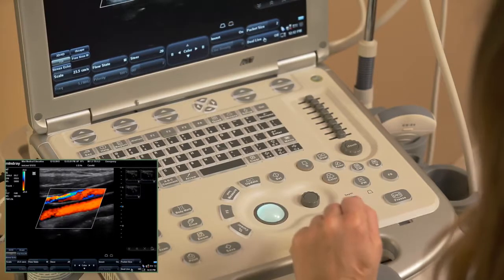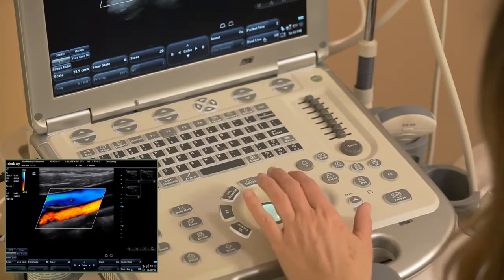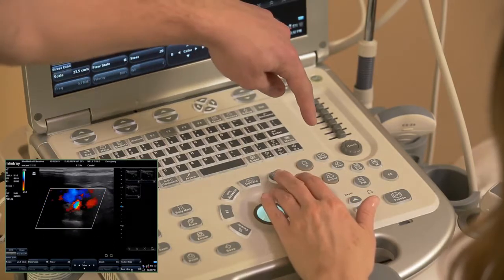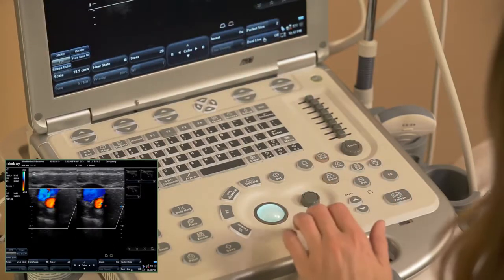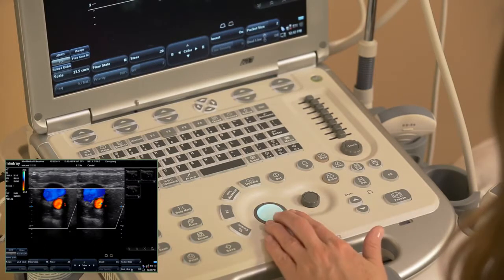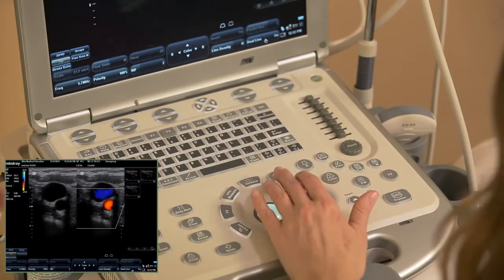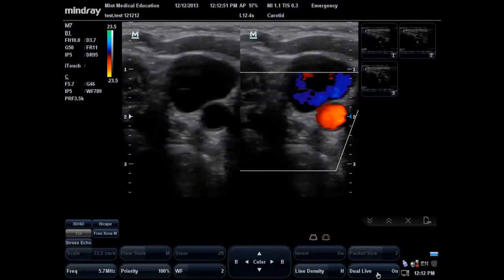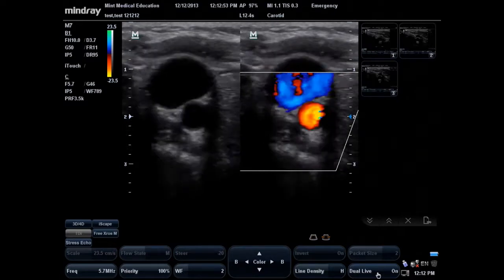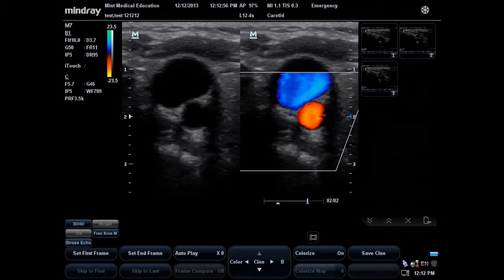Can we talk about dual? Absolutely, yeah. So you'll see that when you have the color on that there's an option for dual live. And so if you go ahead and press the dual button, which is just to the right of B mode, you can pull on a dual screen image, and if you select dual live to be on, it'll make it so that if you're doing a vascular study or you want to check the compressibility or to show that a vessel's patent, you could show one side compressible and maybe one side with the color flow. That's nice. I like that.